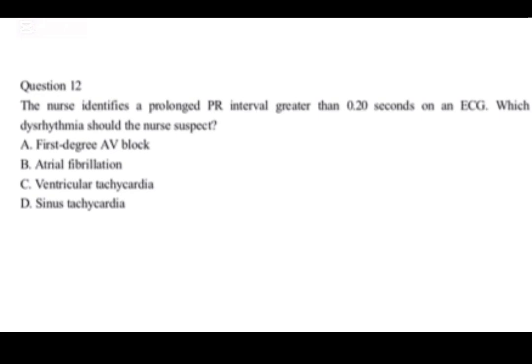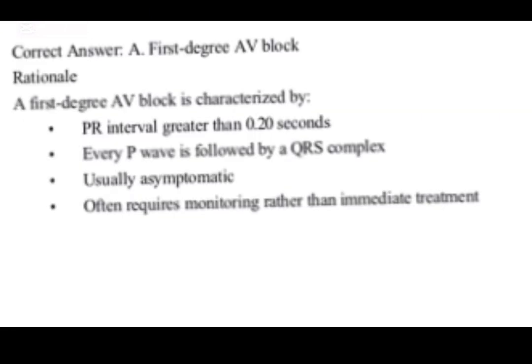A. First-degree AV block. B. Atrial fibrillation. C. Ventricular tachycardia. D. Sinus tachycardia. Correct answer: A.